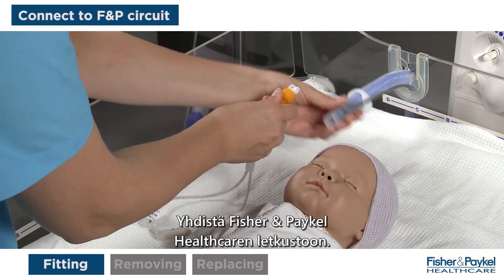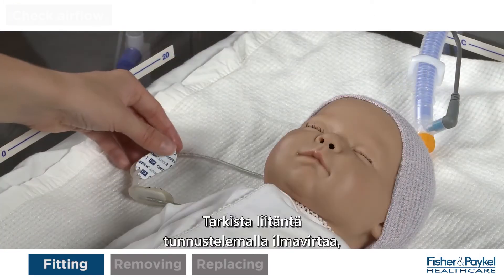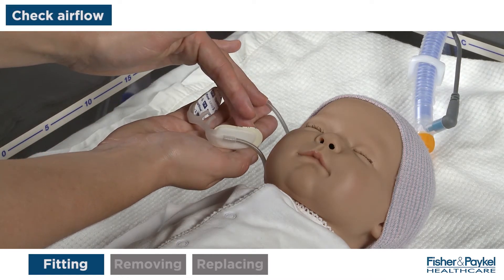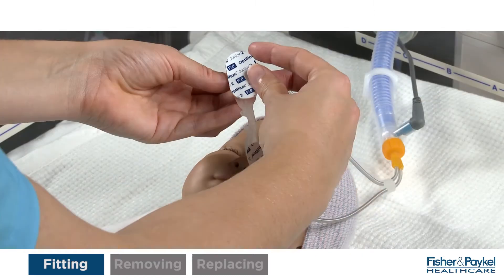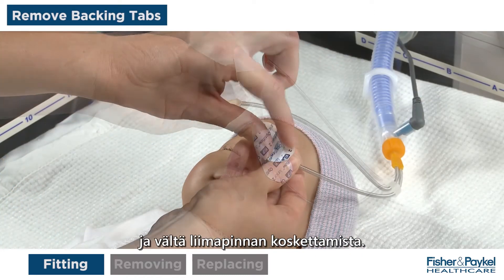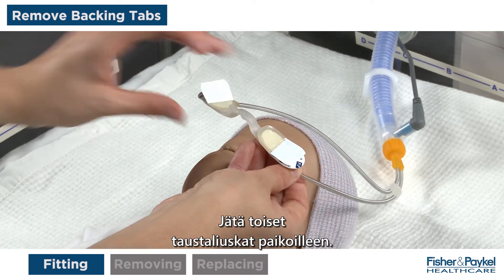The medium-sized cannula selected can now be removed from the packaging. Connect to the Fisher & Paykel Healthcare circuit. Check the connection by feeling the airflow through the prongs. The circuit can be secured to the bedding using the tubing clip.